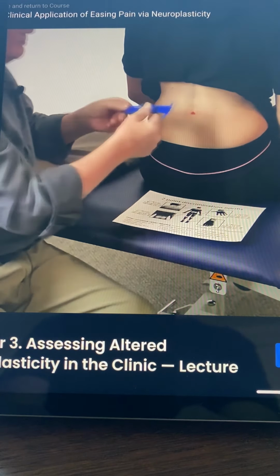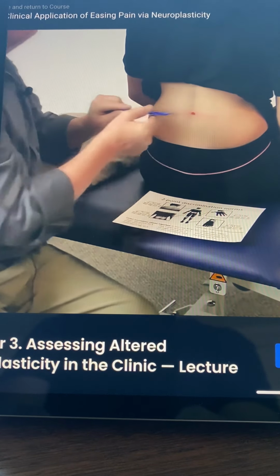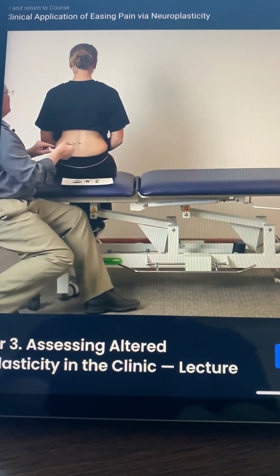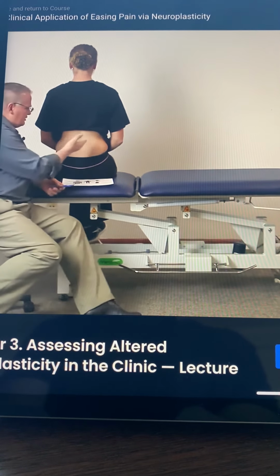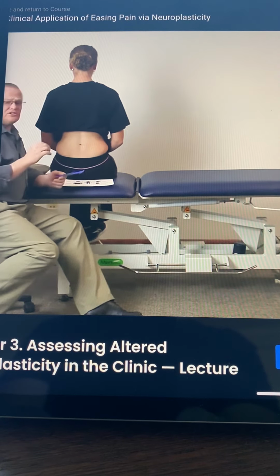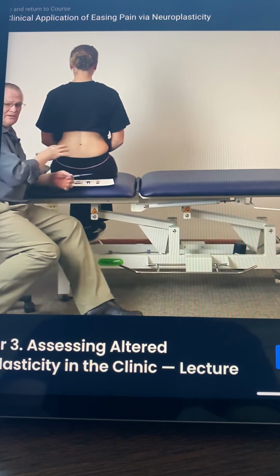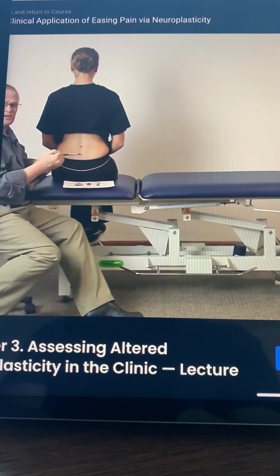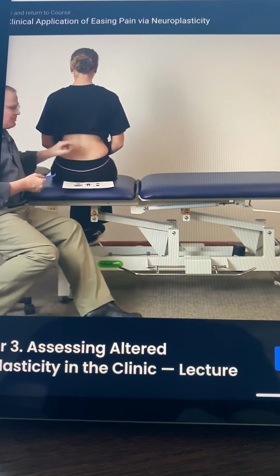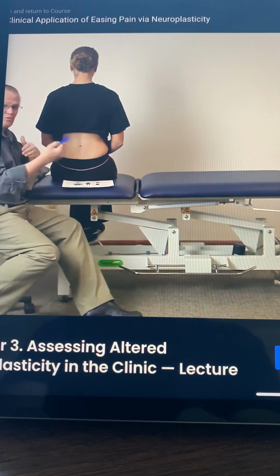1. 1. 2. 2. In this case, you can notice that she has a pretty good location of 5.5 centimeters. Typically, the patient would have to get at least 2 out of 3 correct for us to have a well-established baseline. If she struggled, we would move the calipers further and further apart. Mostly, as shown with chronic low back pain, the calipers can move as far as 10 centimeters apart before patients can pick it up as 1 or 2 points.